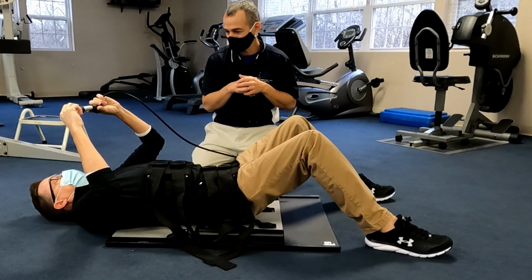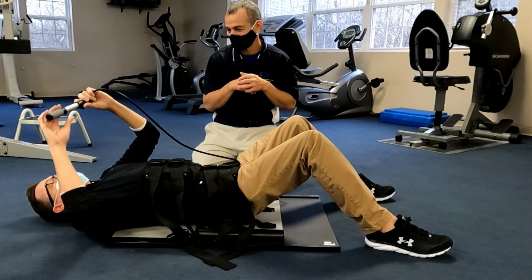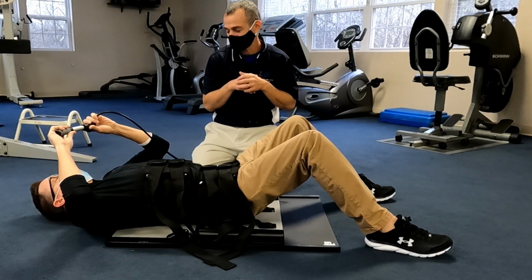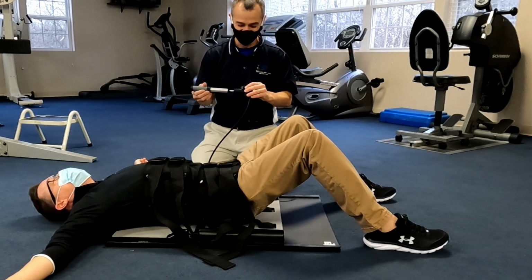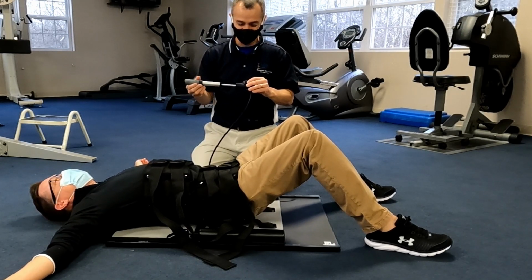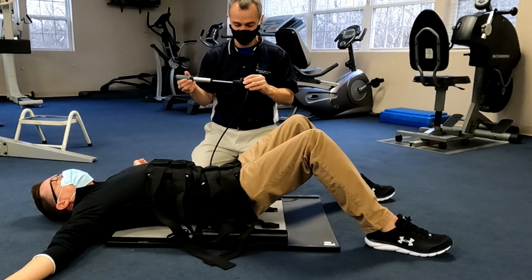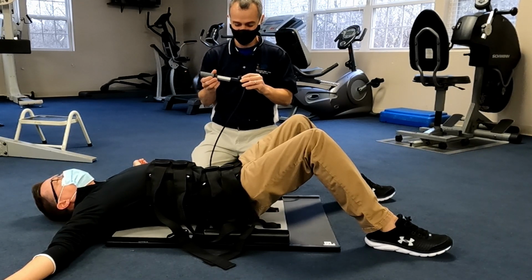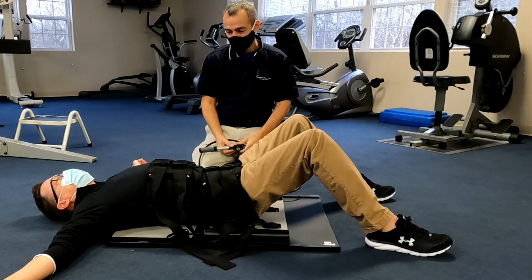What are you up to? Can you see it? Here, let's see. I think they need to make that dial bigger for old people. All right, so I'm going to bring up the digital readout. All right, so that's 20 pounds right there. Feels good.